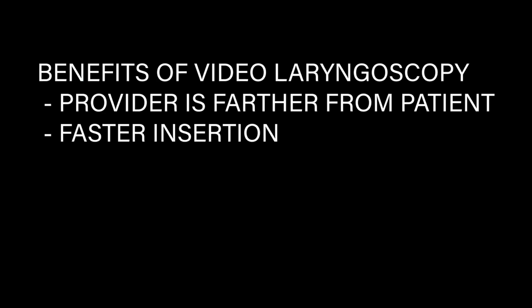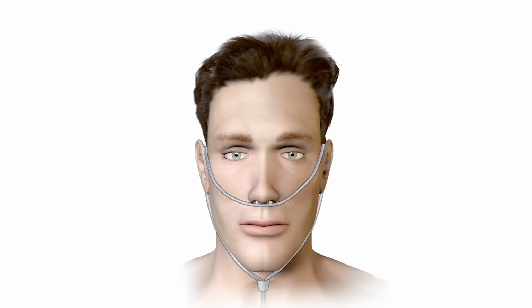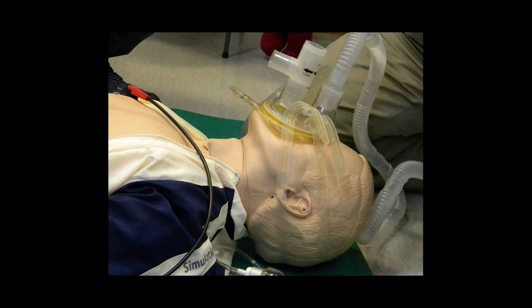Video laryngoscopy is preferred over direct laryngoscopy for 2 reasons. The provider is farther from the patient, and the time to ET tube placement is likely faster. Ideally, the patient should be pre-oxygenated and denitrogenated by applying oxygen via high-flow nasal cannula or with CPAP. The nurse can then administer sedation and paralytics.